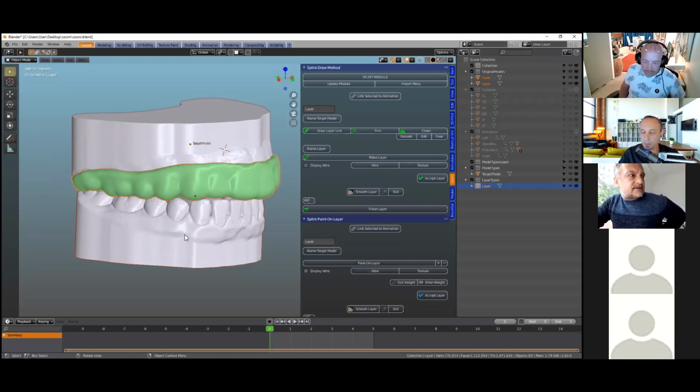So the question is following. At first, we made an offset model. Can you stop at that point with the offset model, or must you go through the program, the other retentive or passive model, and then delete it? Or can you just stay on the offset model and say, okay, I'm satisfied, I need my offset only?